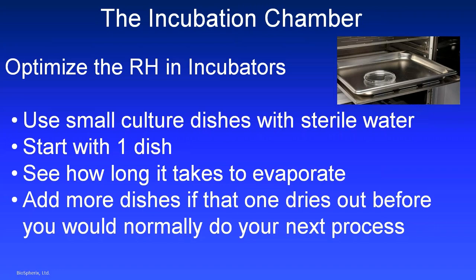If one dish goes dry between processing days, then add a second dish. And you can add a third dish if you need to, but honestly, we don't usually seem to even need 3 dishes in an incubation chamber. But there are a lot of different factors that can affect that.